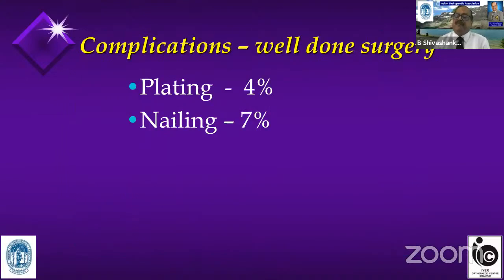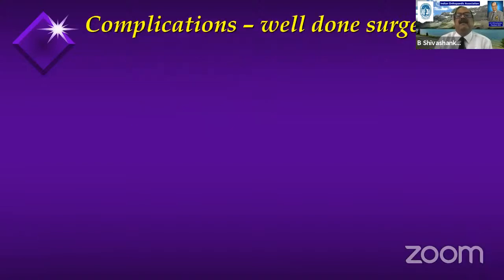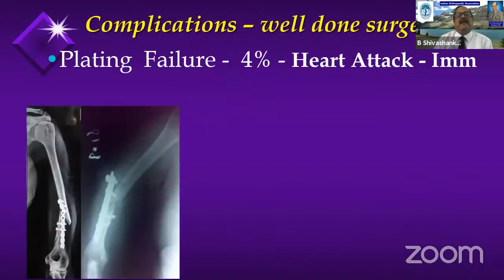Friends, complications. Definitely plating, well done plating complications are less compared to nailing, but the difference is not too much, because almost 10% of the cases, if they have got some minor complication, that is acceptable. To give an example, plate failure patient is like a heart attack. If a plate fails, the patient is incapacitated. The patient becomes disabled. They come and get the surgery done immediately.